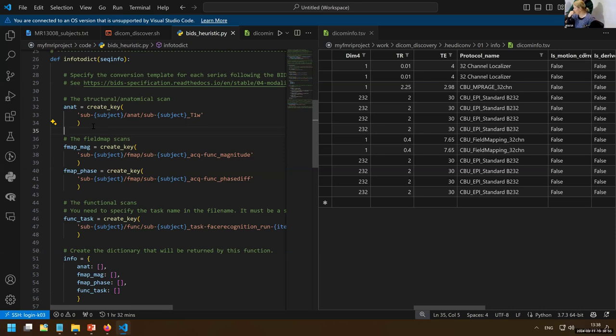Is that still acceptable practice for data sharing when it's impossible to be done? I think so, yeah. You often get BIDS warnings which are not critical. In most of my experience, if it's just missing data, it's a warning that you haven't got the particular value for this particular subject. But even if you have failures, I still think it's better than not having it at all.